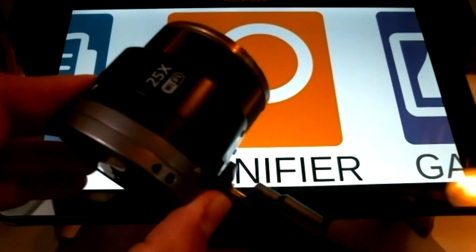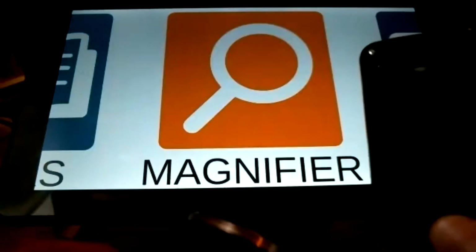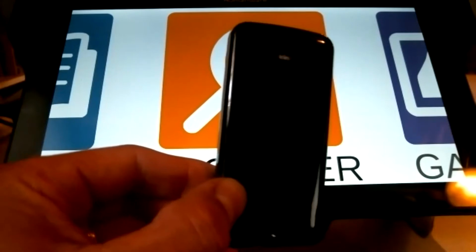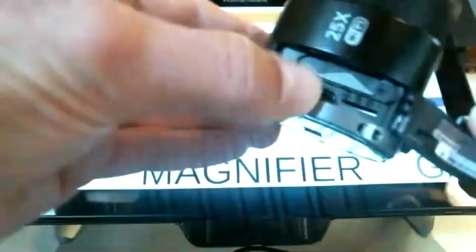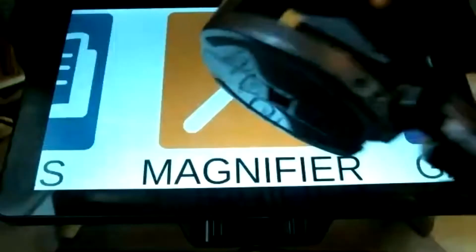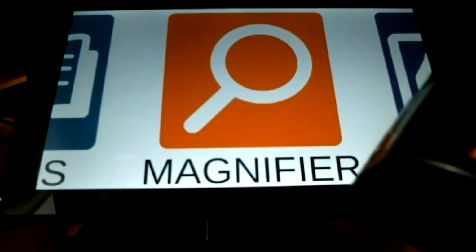What I like to do, and we do have that in our store on the website, or you can buy it anywhere else, is buy a little external battery pack that you can connect to it. With a little cable, you connect the cable to the battery, and then you can just open the little door on the side of the camera, and there's a little USB connector here that you can connect my external pack to. And what I did is I just put a Velcro on the back, and then I can stick it on the side of the stand, of the Connect 12 stand.